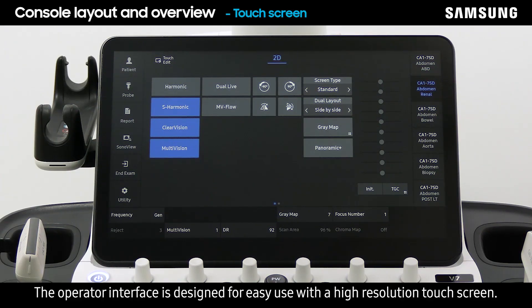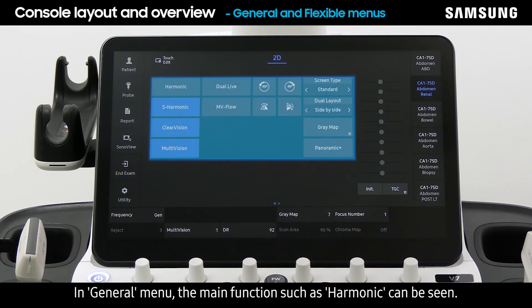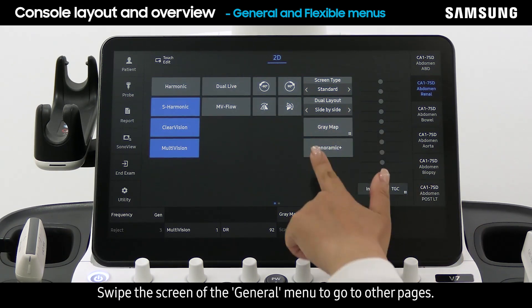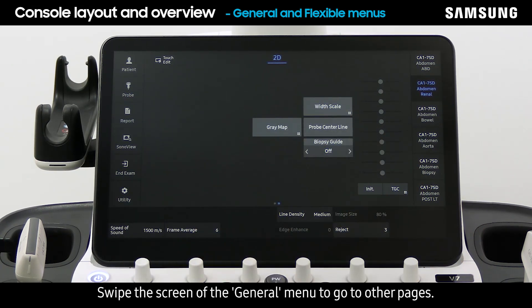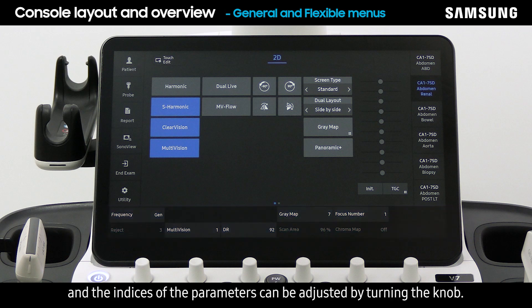The operator interface is designed for easy use with a high resolution touch screen. On the touch screen there are two menus: general and flexible. In the general menu, main functions such as harmonic can be seen. Swipe the screen at the general menu to go to other pages. The flexible menu is interlinked with the knobs below, and the indices of the parameters can be adjusted by turning the knob.